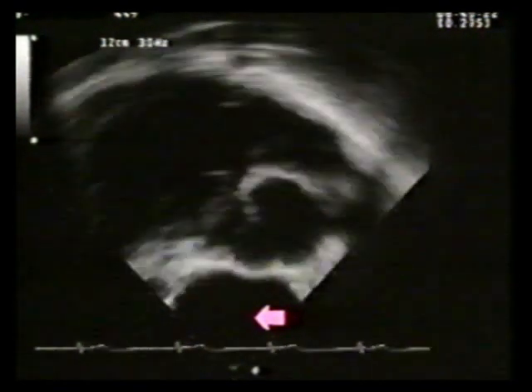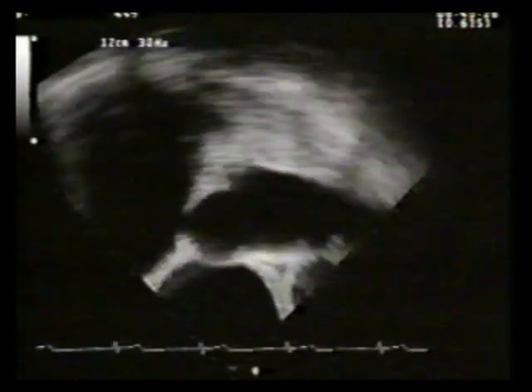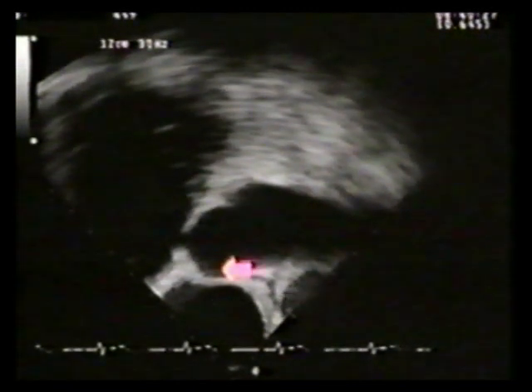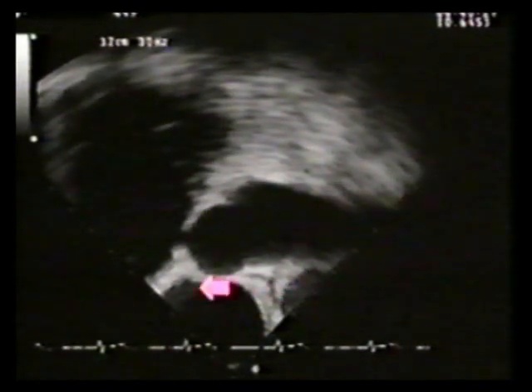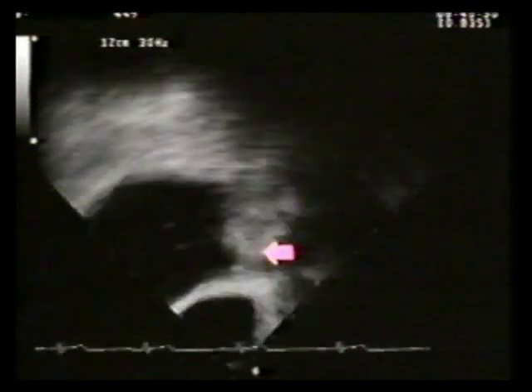The left atrium is posterior, with further rightward rotation of the transducer. An oblique section of the ascending aorta is the primary structure. The ascending aorta is cut in long axis. Posteriorly is left atrium. The right pulmonary artery is cut in short axis, posterior to the ascending aorta. A portion of the atrial septum separates right and left atrium.